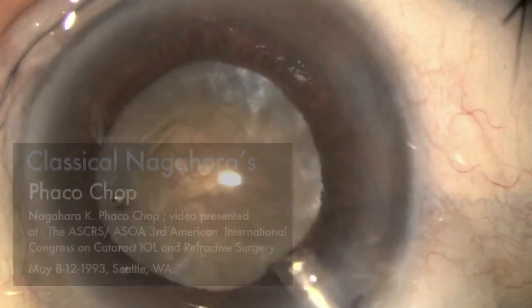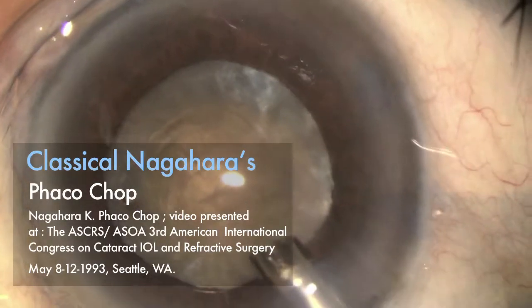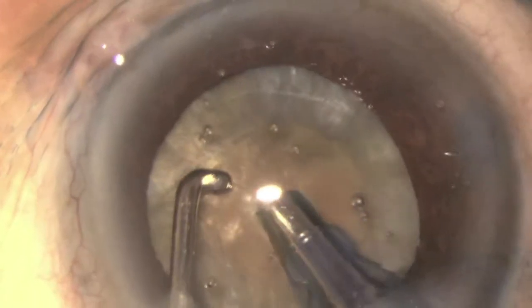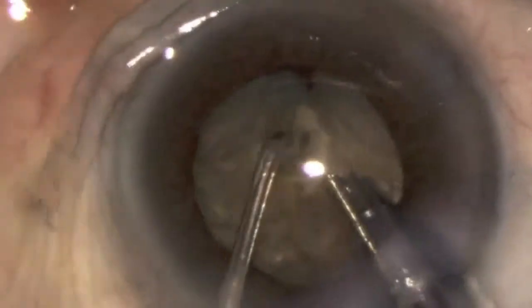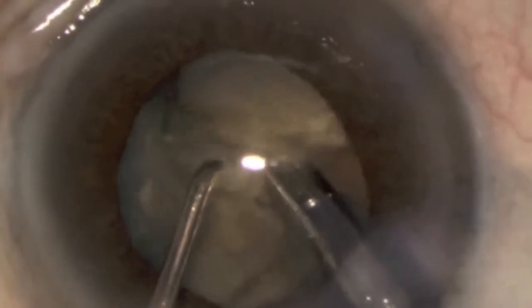Similarly, Nagahara's horizontal chop technique also utilizes compressive forces deep at the strongest central nucleus. Drawing the chopper through the dense, hard, leathery, bulky central nucleus is often difficult. Misdirected vector forces cause rotation of the nucleus, resulting in incomplete nuclear segmentation. Incomplete nuclear division, along with conjoined segments, needs unnecessary prolonged manipulation with excessive use of phaco energy.